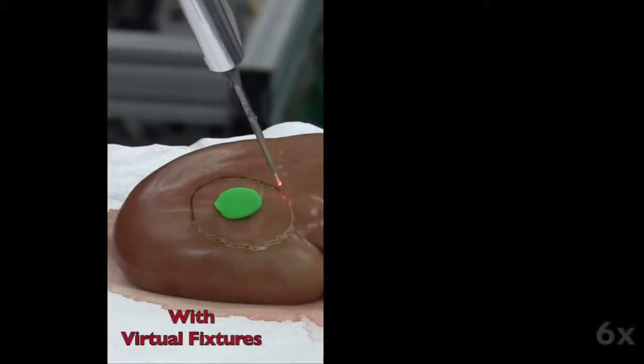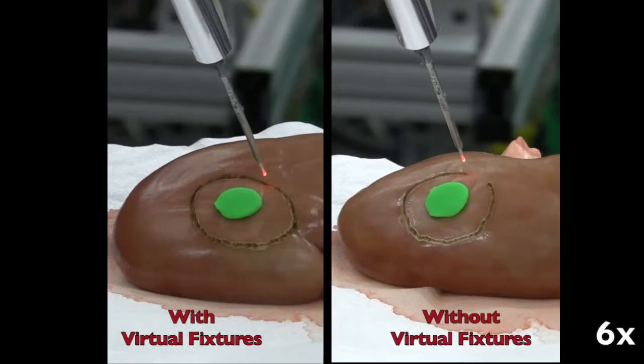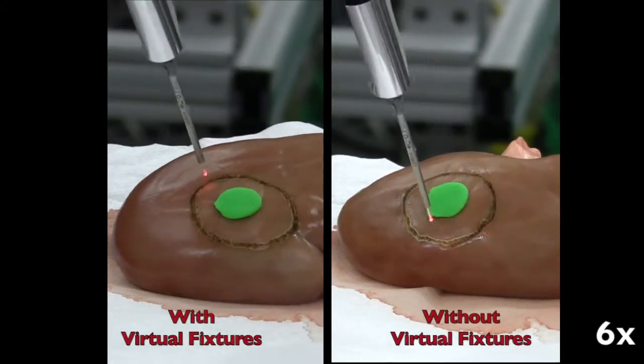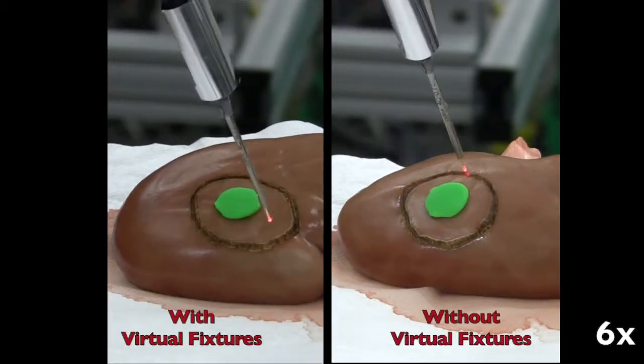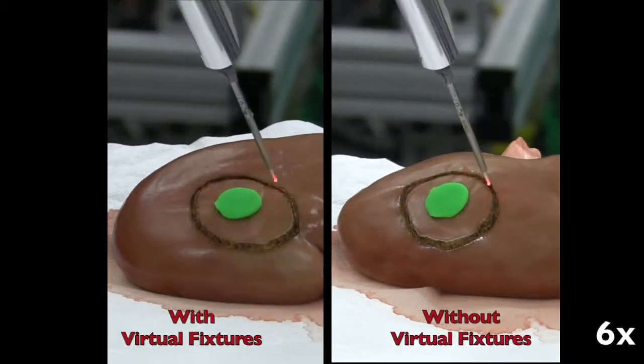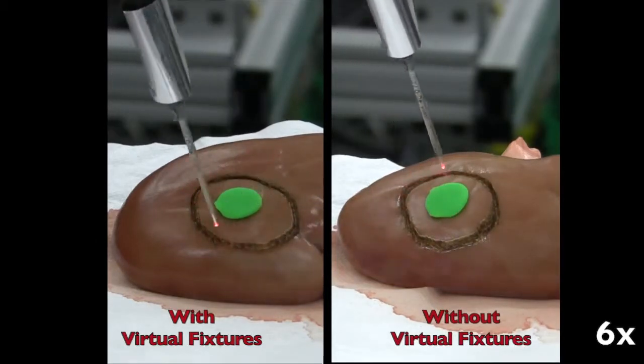Interestingly, there was less fatigue. I was also able to go faster with the virtual fixture and still maintain nice fixed concentric circles. Whereas when I was manually controlling, although my circles were still fairly tight on top of one another, I had to slow down to make sure that I was as precise as possible. It is possible that the virtual fixtures may offload some physical workload and some mental workload of the surgeon to make surgeries more expeditious.